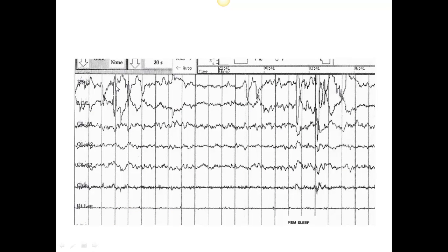Here's another example of REM sleep. Again, rapid eyes, really quiet EEG tracings, and a reduction in the amplitude in the chin.